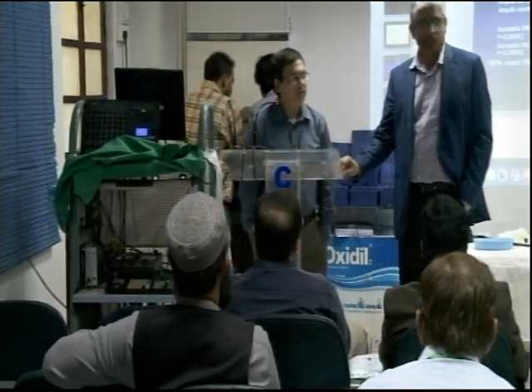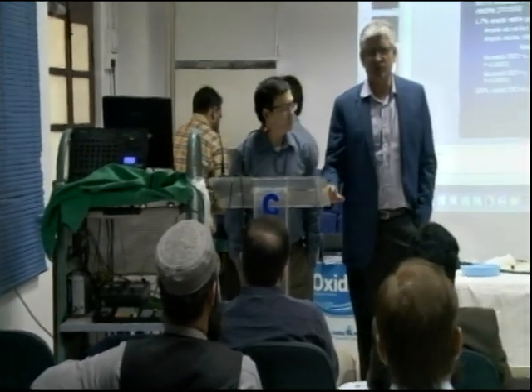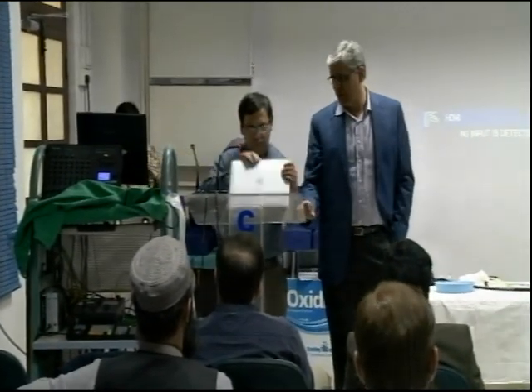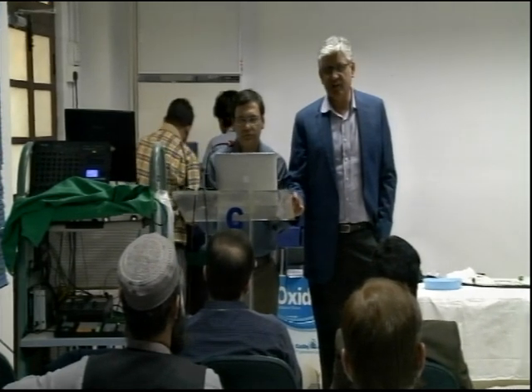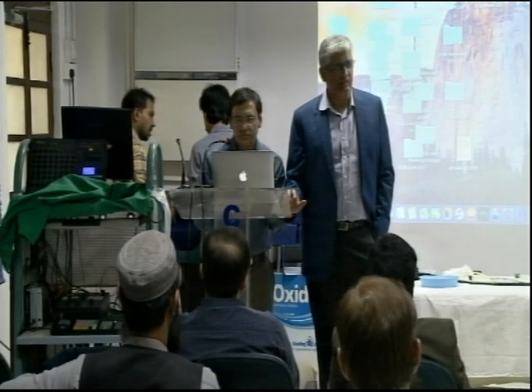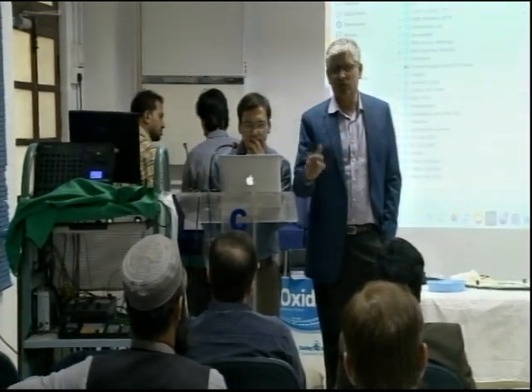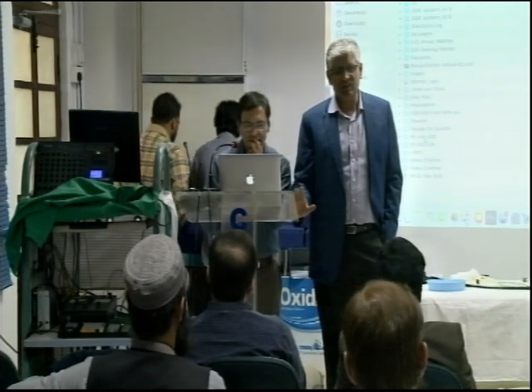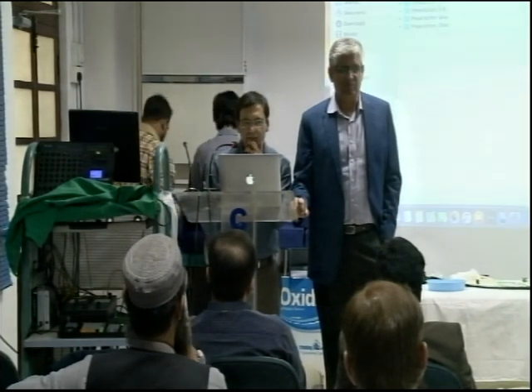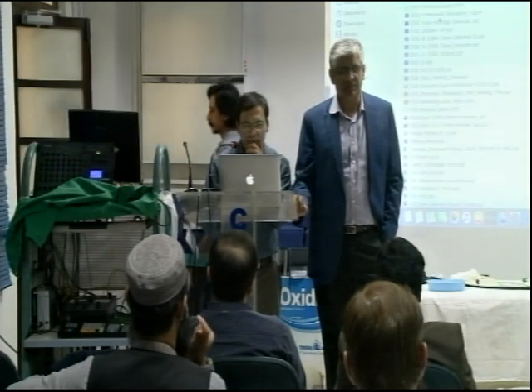Sorry, I can share our experience. I think I mentioned it to you. The paper is sitting with Ali. We've got 160 cases that failed elsewhere, and we have the same results as Khalid. We've had 100% success in all. A few required more than one procedure, but we succeeded in 100% of cases. They were referred from all over the country, either directly or indirectly.